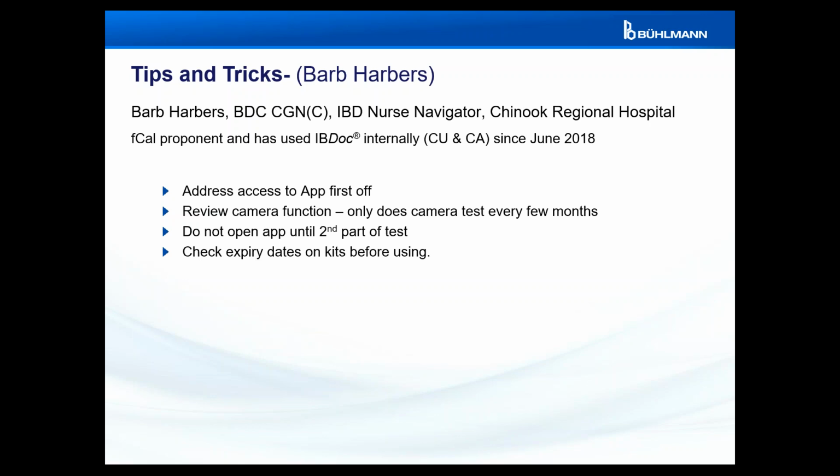But the first thing that happened to us with about our third or fourth patient, I think, he went to do his test, and it failed. I can't remember the reason the test failed, but it failed. No problem. He had 2 kits, so I just said, go ahead and repeat it using the next kit. So he went ahead and did it, and it was the next day. So he phoned me a couple of hours later and said, well, there's a problem with the app. And I said, well, what's the problem? And he said, well, I can't get the camera, it's not testing the camera.